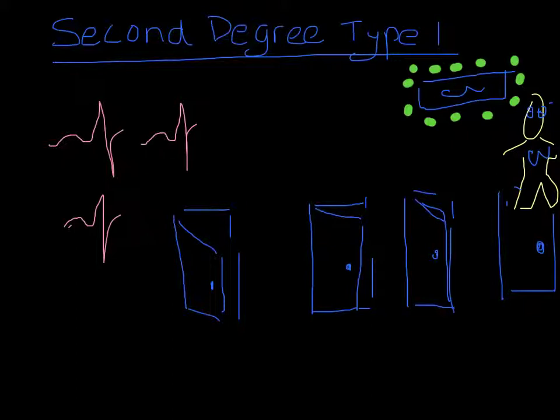What's happening, if you remember, is you're seeing a progressive lengthening of that PR interval. So think of your AV node as the door. So here's the door into the club. We get into the club and our bouncer's there and the door is pretty much open. So we have what we think of as a pretty regular beat going on. The electrical impulse is coming down. We get another one and we have a P wave, but that door is starting to close a little bit. So it's taking a little bit longer to get through.